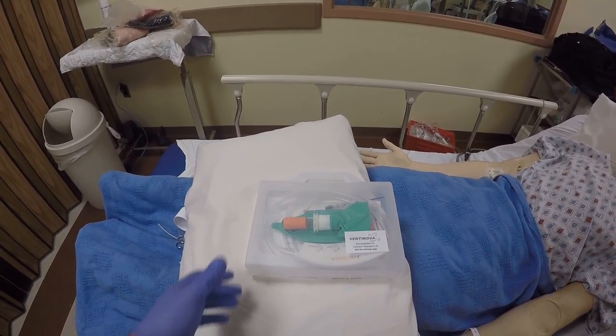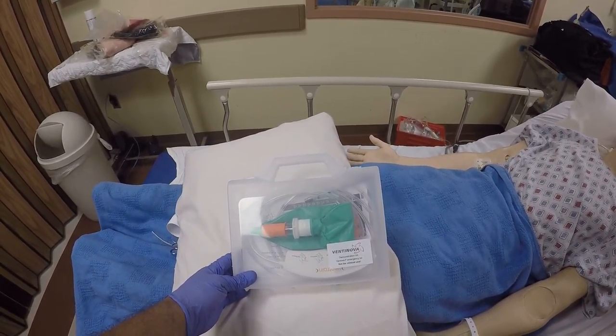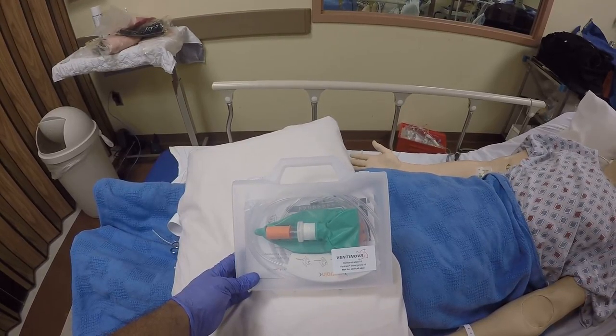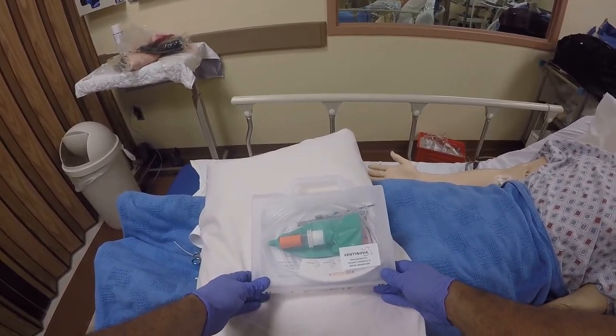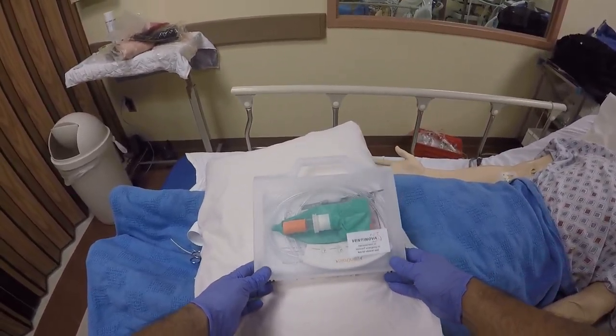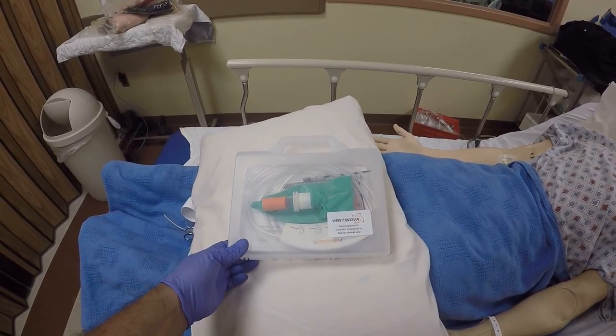Welcome to another School of Airway by Dr. Torres. I work somewhere in New York, in Queens, if that's a clue. So I got a package from the Netherlands — first time I ever got a gift from anyone in the Netherlands. And this gift is to teach me how to use the Ventinova.